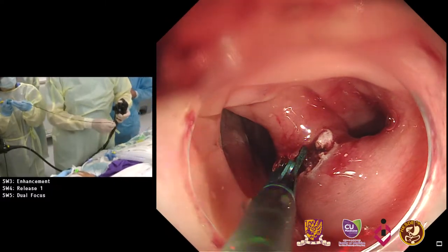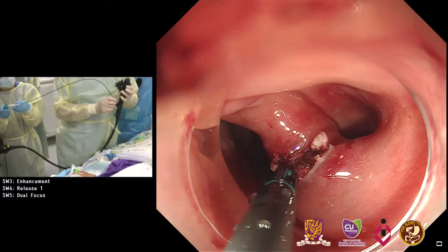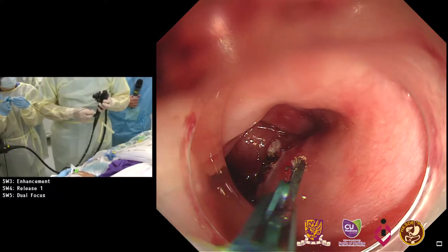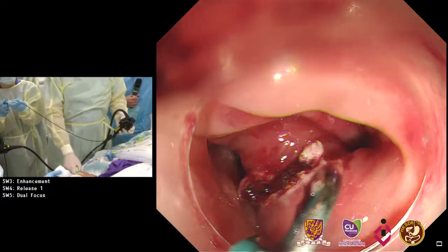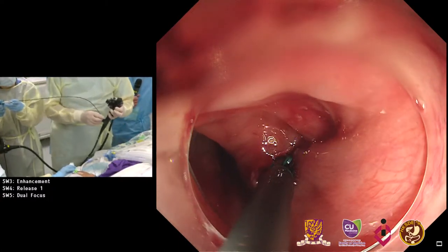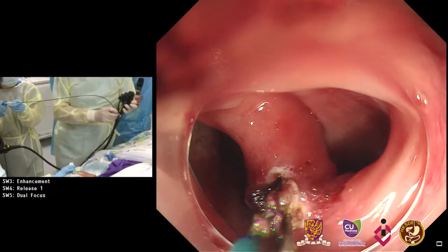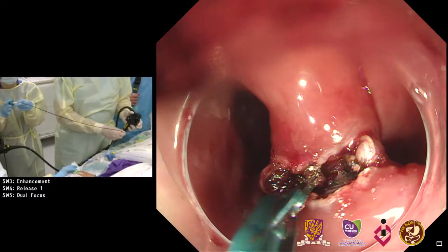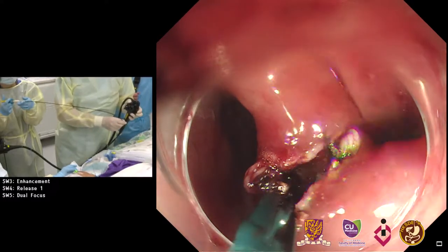You want to talk about your Z-POEM approach? We were actually debating whether to change our technique here. He really has great experience with this double septotomy technique. Usually we use a different tube, and with this tube this technique is not possible. But Z-POEM would have made sense because the tunnel can go very fast — if you have a 6cm septum, the tunneling technique can go very fast.